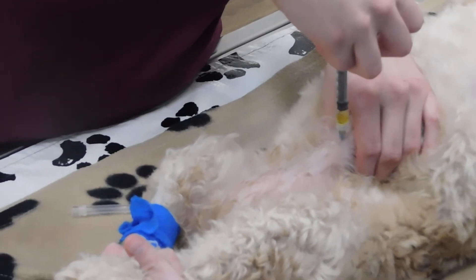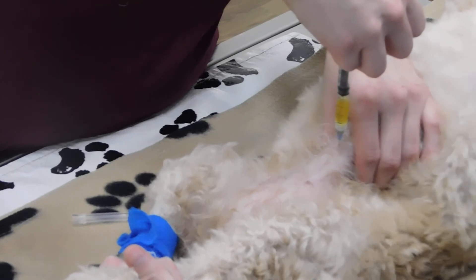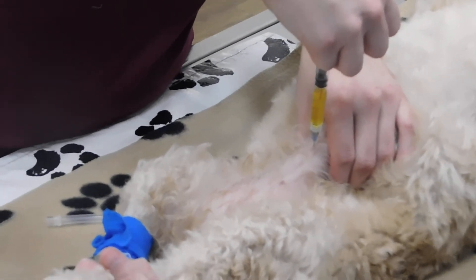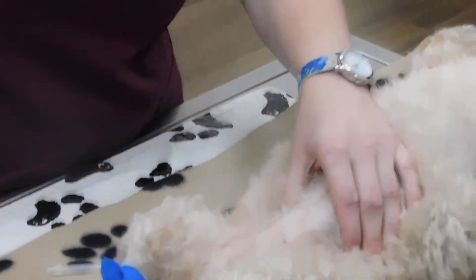Here I'm aspirating. I'm going to stop drawing on the plunger and pull the needle straight out.